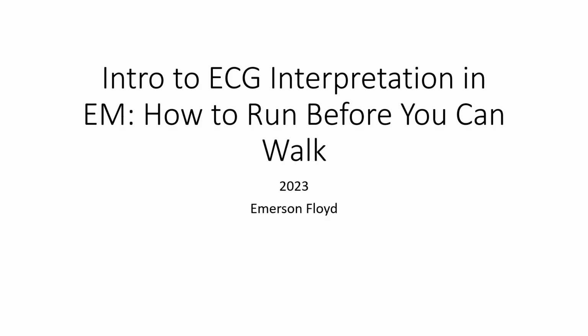Welcome. In this video, I'm going to discuss how I look at an ECG in the ED and what I'm looking for. At the end, I'll discuss how we'll apply a basic approach to interpreting ECGs over the course of the year. I remember being mystified as a sub-I watching attendings sign ECGs within a few seconds. I soon figured out that they were just looking for STEMI criteria meeting ECGs, which partially explained the speed. We're going to talk about how to be efficient from the beginning.